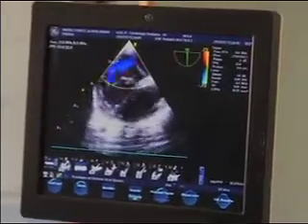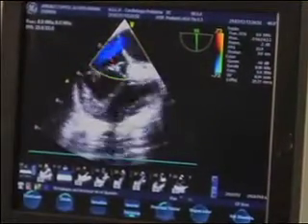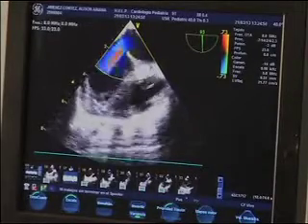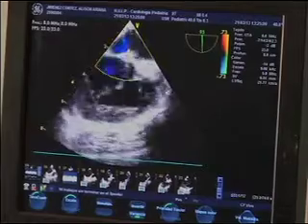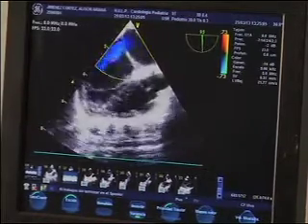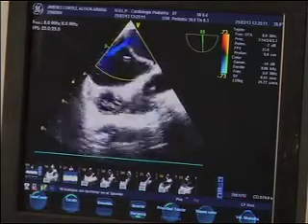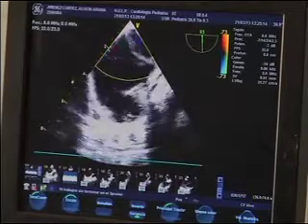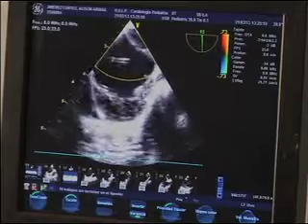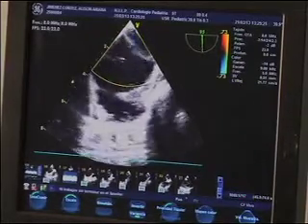It could take a long time to get a good place. I mean, these aren't difficult. There's no doubt the tools we have for them are not perfect. And also, I guess in terms of the punctures, you don't have the SVC to come back out of. No. Está muy adelante, yo creo, muy cerca de la aorta.